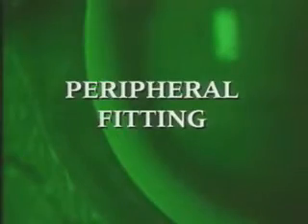Peripheral fitting. Once the best radius is determined, the next step is to analyze the peripheral fitting pattern. The degree of edge width and lift must be optimized to allow for adequate lens movement and to provide for a free exchange of tears behind the lens.